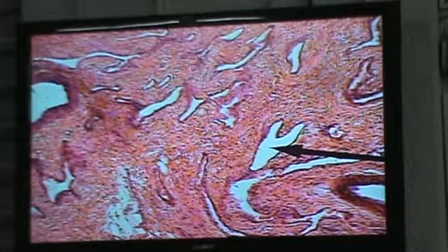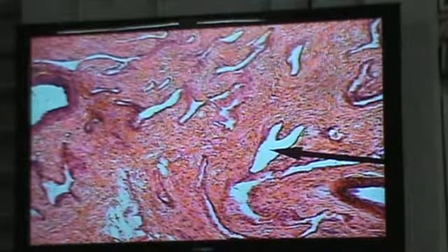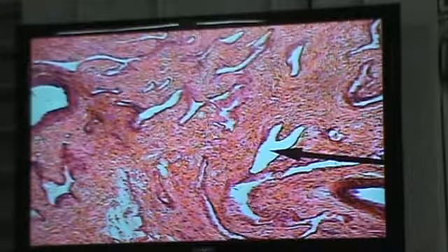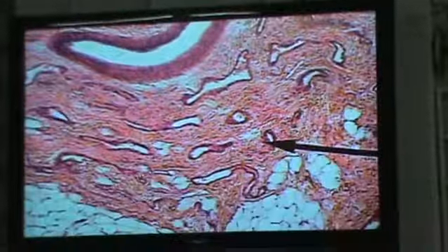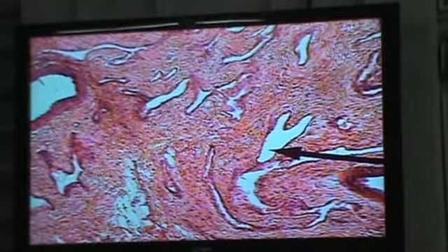But actually, this slide we had yesterday, we saw where the seminiferous tubule was transitioning to the straight tubule and then into the rete testis. So in this one here, we're seeing just a section, a different profile showing a lot of the rete testis. There you can see irregular shaped spaces. Alright? Irregular shaped spaces. Okay?